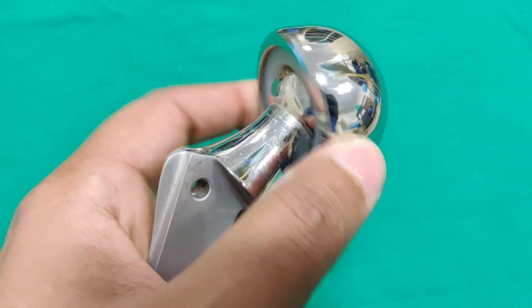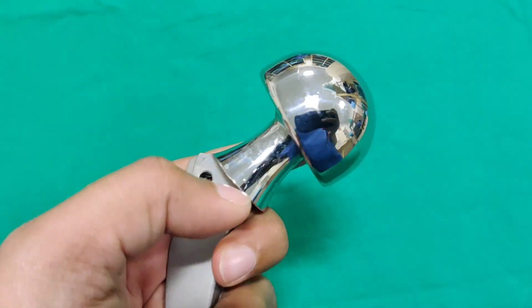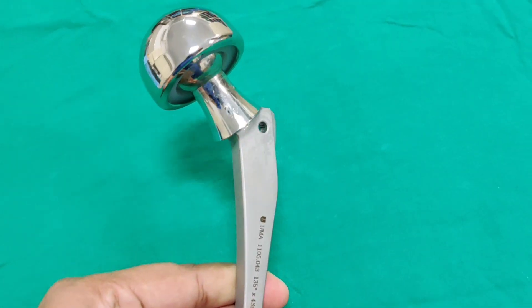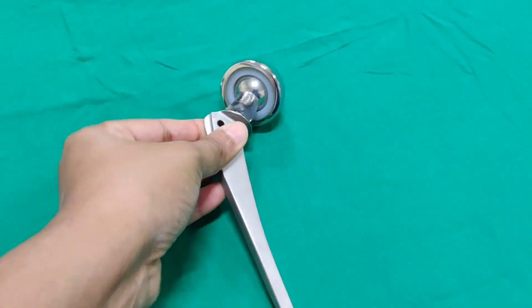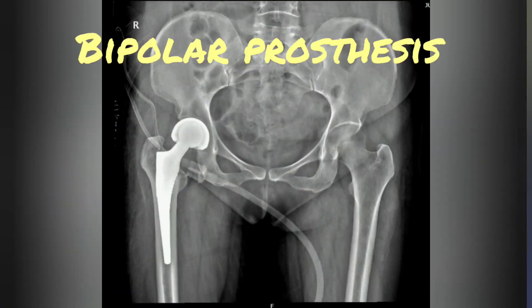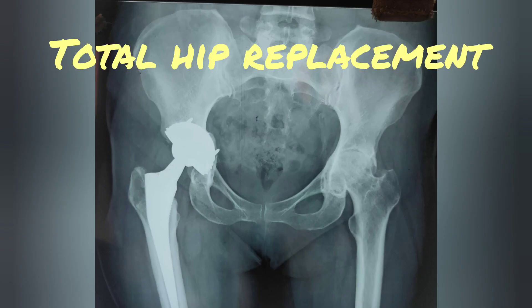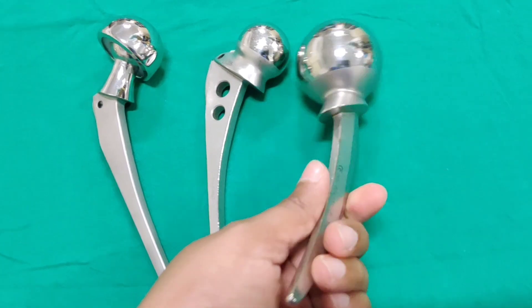The inner head moves in the interprosthetic joint and the outer head moves inside the acetabulum — that is why it is called a bipolar prosthesis. Cemented fixation is preferred, but with good bone stock, uncemented fixation is also possible. Advantages include increased range of motion and less acetabular wear. However, studies show the articulation between the outer and inner head is lost after about 3 months, and the bipolar becomes unipolar. To overcome this, there is a bicentric bipolar prosthesis.